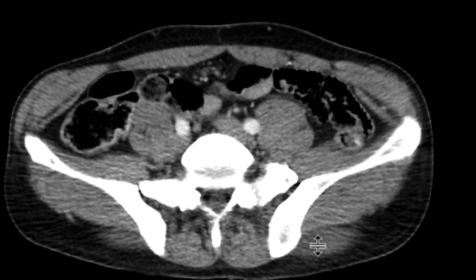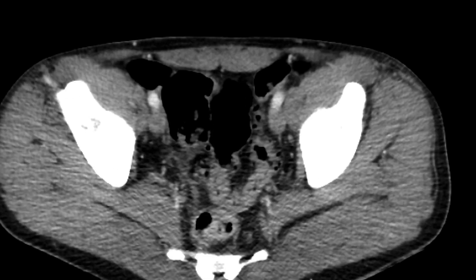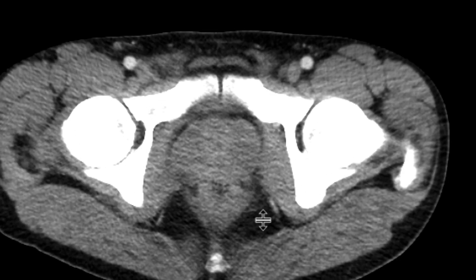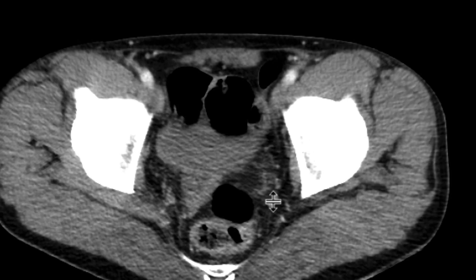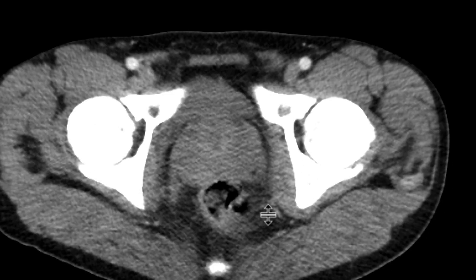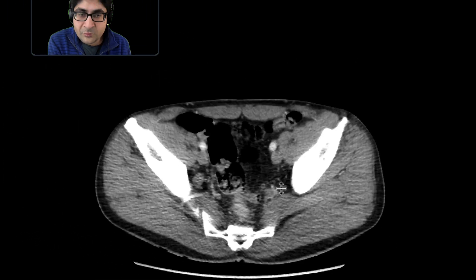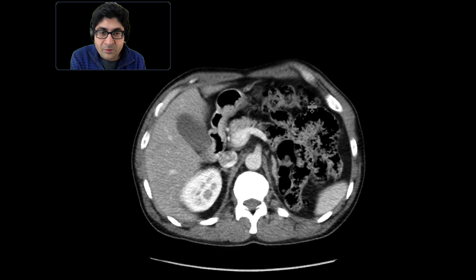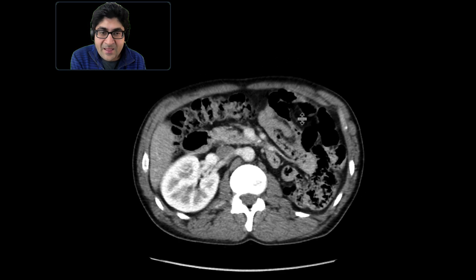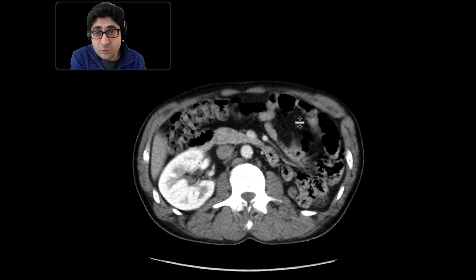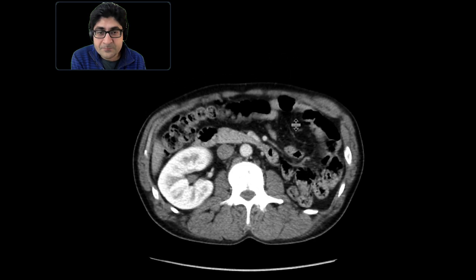The other clue is if you look at the seminal vesicles — on the right side it's present, but on the left side we don't really see it; it's probably atrophic or maybe absent. That's another ancillary sign we can look for to confirm our suspicion that this is indeed an absent left kidney. This patient has only a solitary right kidney.